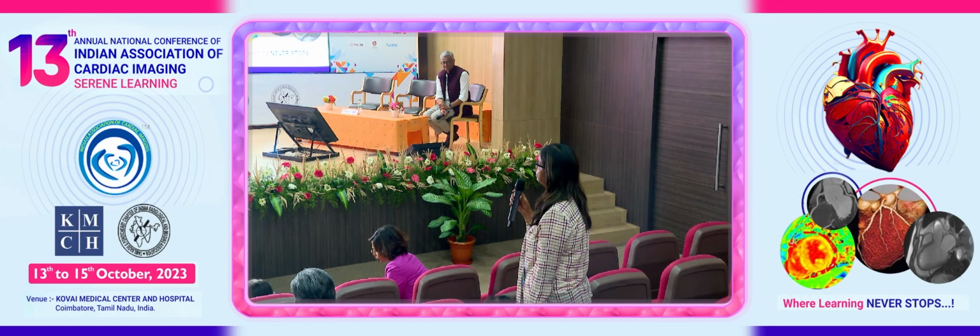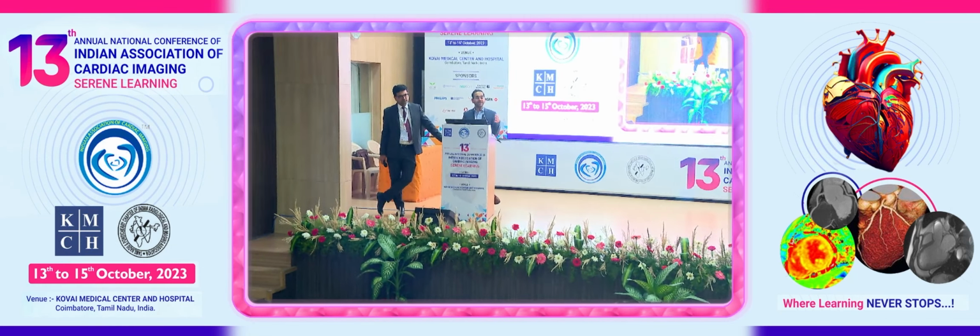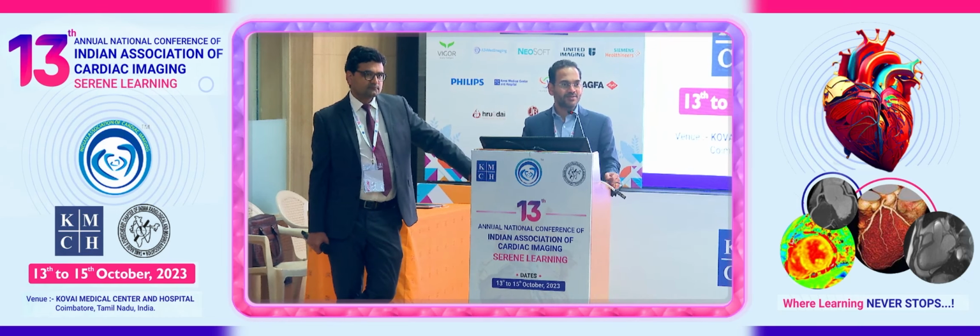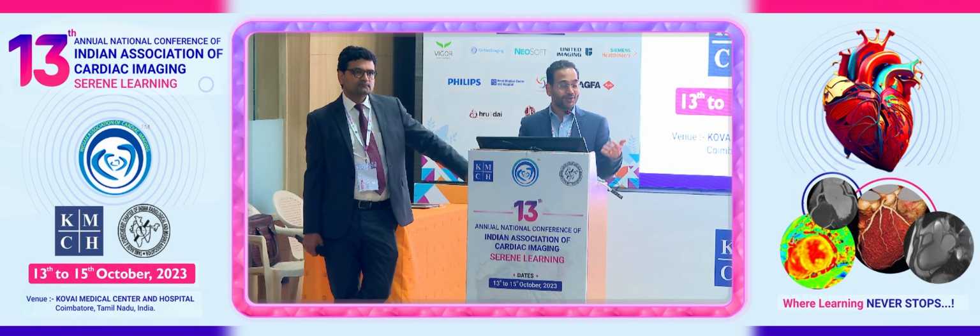There is ongoing data in the literature that says plaque volume quantification will be coming down the pipeline. It has not made its way yet into the ACC or AHA guidelines, but that might change in the next couple of years. With regards to whether you should report the overall plaque burden, if you have the resources to do it for every single case, good for you. We do about 60 coronary CTs in a day with 2 people managing the scanner, and it's just not feasible in our system.